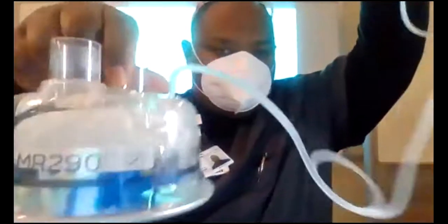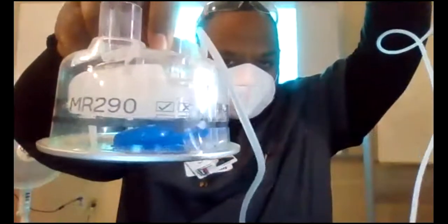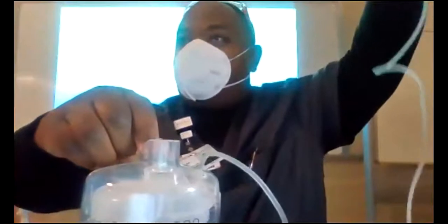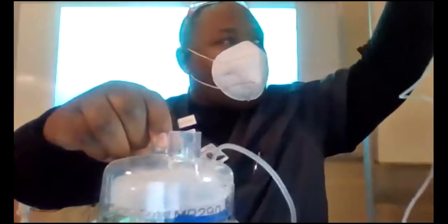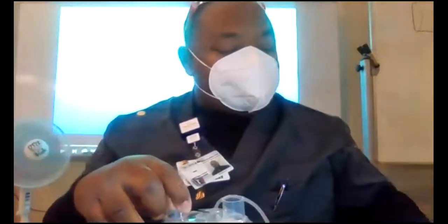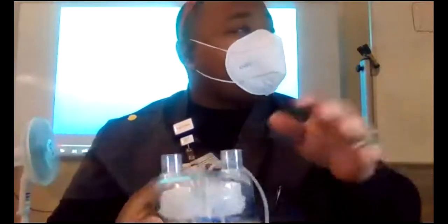And feeding water. See the water? Squeezing a bag, but it would hang on the ventilator or whatever device you're using, and it would just constantly produce water. It will keep on giving water as it sits on a heating plate. Usually when we're putting the water in it, it's on a heating plate, but sometimes it might not be. It's just a Passover. It'd just be picking up the regular water, right? But if it's on a heat, it's going to have a better opportunity to hold more water, right?